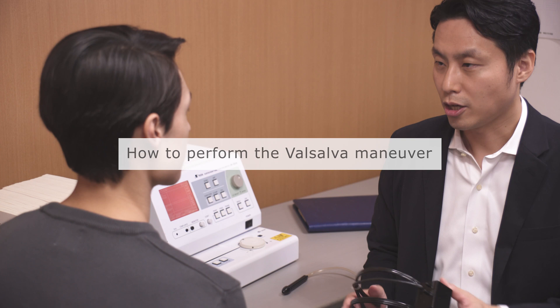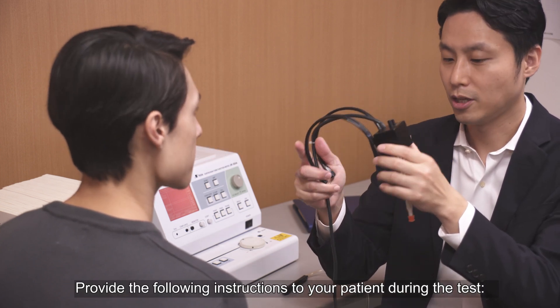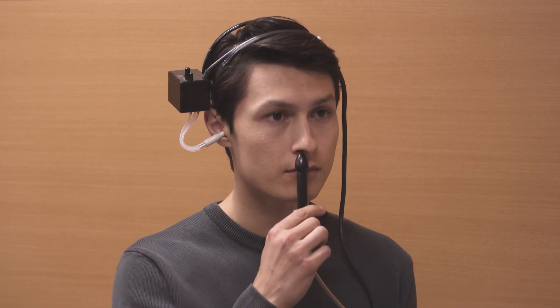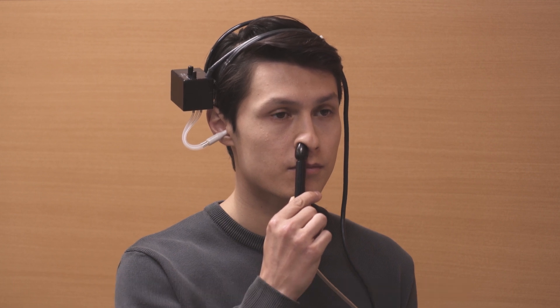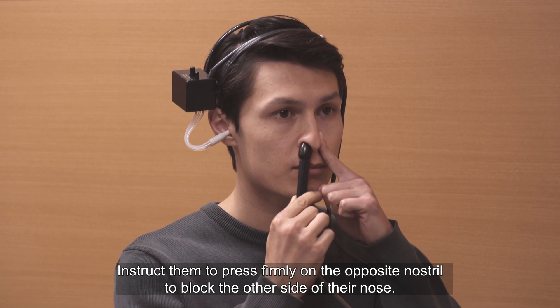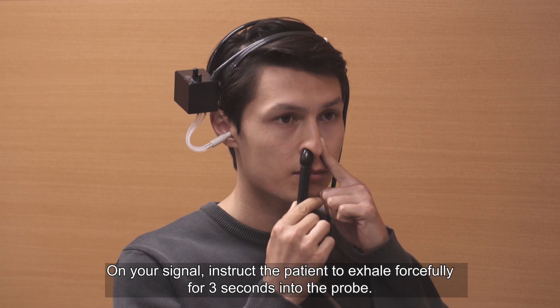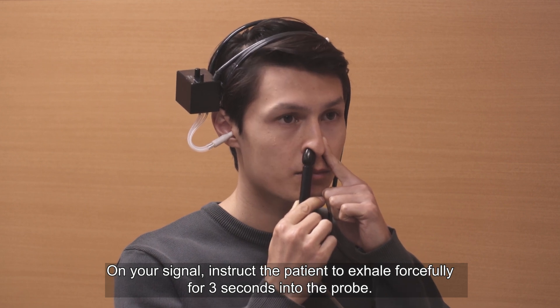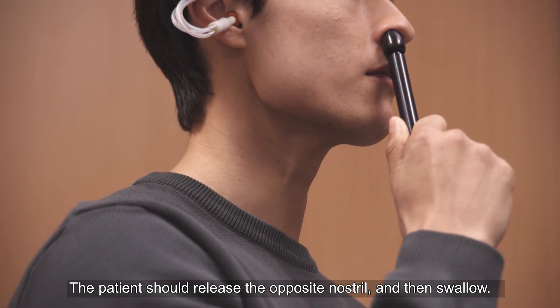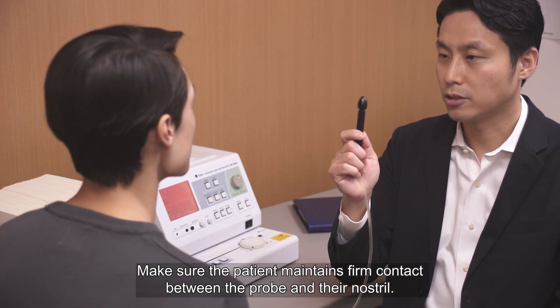How to perform the Valsalva manoeuvre: provide the following instructions to your patient during the test. Ask the patient to insert the probe into one of their nostrils, making sure the probe does not move during the test. Instruct them to press firmly on the opposite nostril to block the other side of their nose. On your signal, instruct the patient to exhale forcefully for three seconds into the probe. The patient should then release the opposite nostril and swallow. Make sure the patient maintains firm contact between the probe and their nostril.